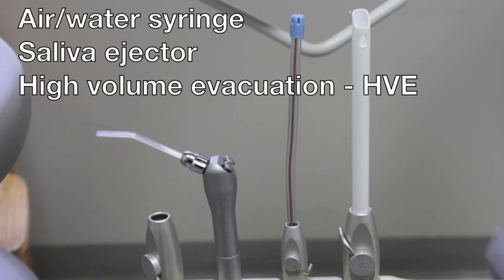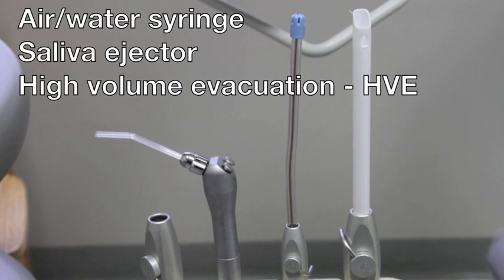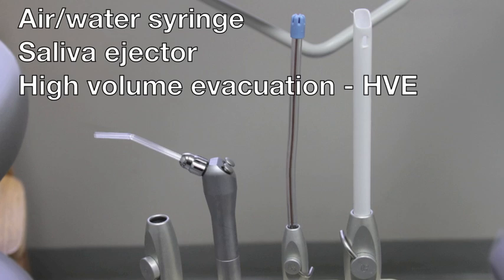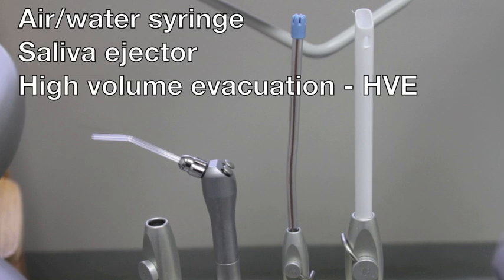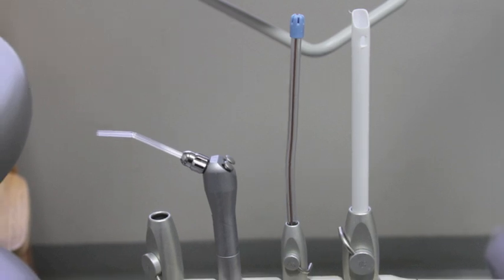Next we'll be looking at instruments that are typically attached to the chair: the air water syringe, the saliva ejector, and the HVE or high volume evacuation. The air water syringe, as seen here on the left, is a device that will cause water, air, or a combination of both to flow. This is used to rinse and to dry structures within the mouth, also called the oral cavity. As fluids are placed into the mouth, it's also going to be necessary to remove them — this is called evacuation.